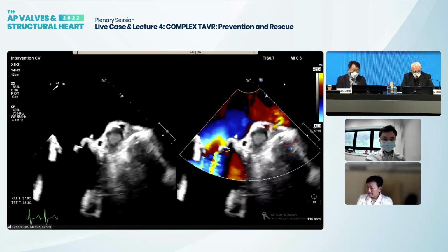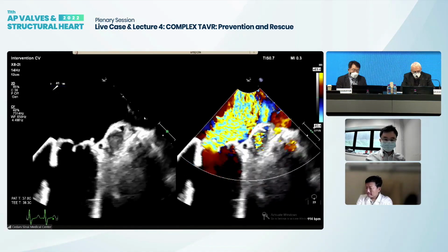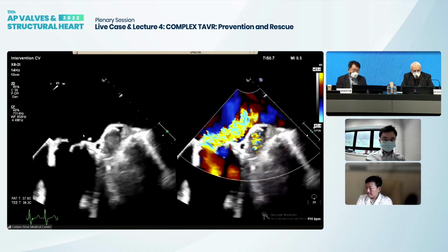Yes, so as you can see here in the bicommissioner. Can you hear Moody? Yes. Yep. Moody, Everything speak. good.